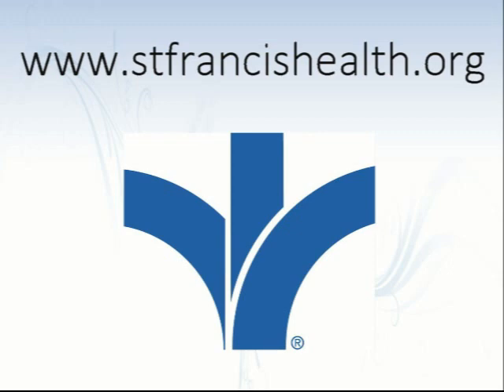Dr. Grabarczyk, I understand you spend a lot of time in the cath lab at St. Francis performing heart catheterizations. Exactly what is a heart cath? A heart catheterization is an actual study we perform in the hospital where we evaluate the patient's heart arteries.